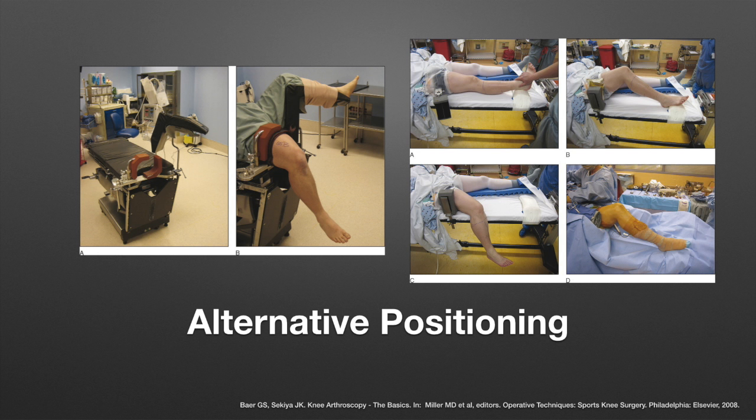Two alternative positioning techniques are commonly used. In the first technique, the lateral post is placed at the mid-thigh with the leg in extension, and the leg is then dropped over the edge of the bed. This technique is not employed here, as it places the foot at risk for contamination.